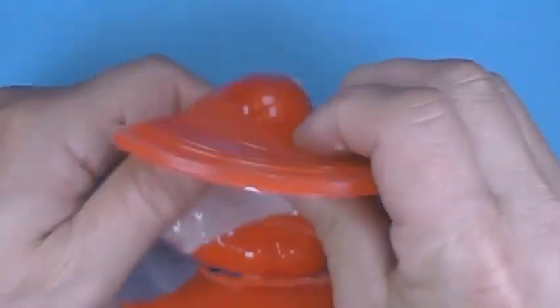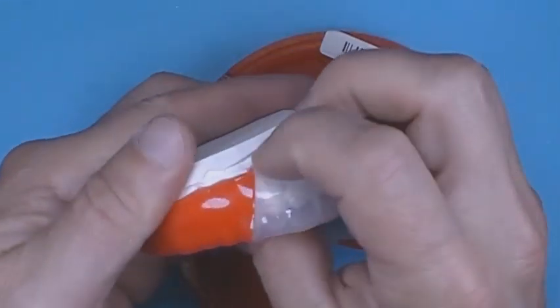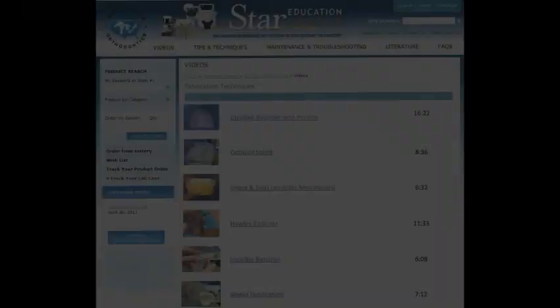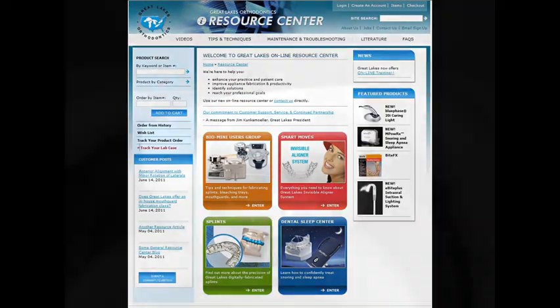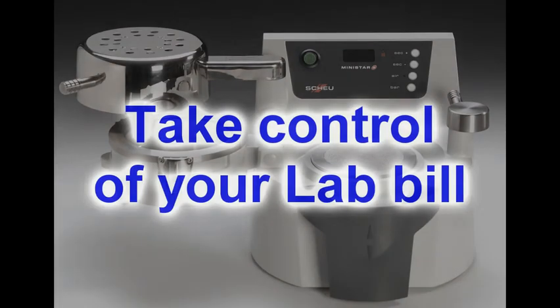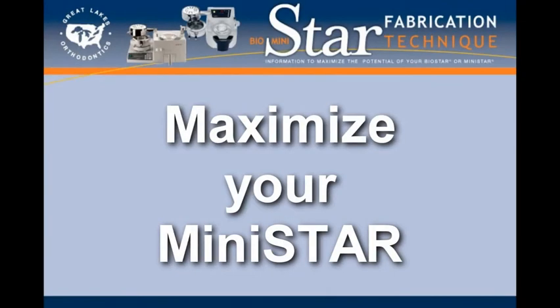Remove the outer plastic and rough cut the mouth guard from the model. Trim and finish following standard mouth guard procedures. These technique videos, along with other information on the Resource Center, can show you how to get the most from your machine and how to ultimately take control of your lab bill. Maximize the potential of your MiniStar.